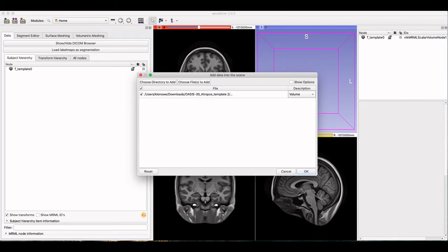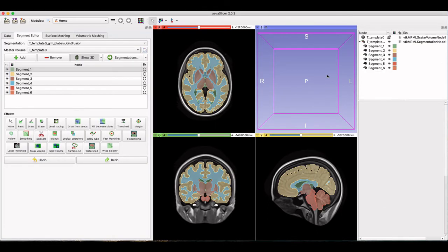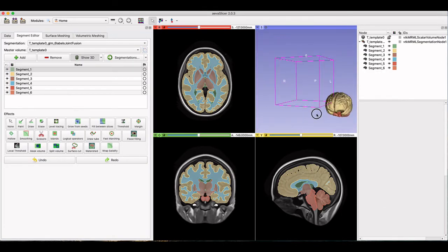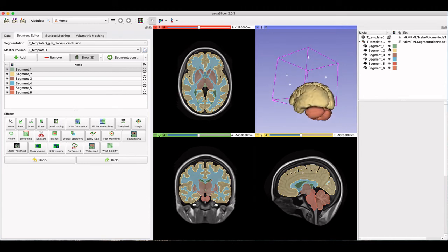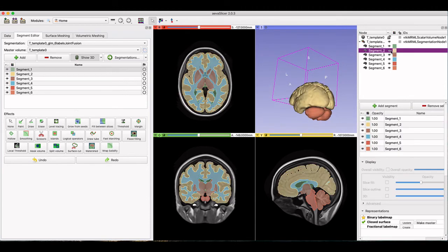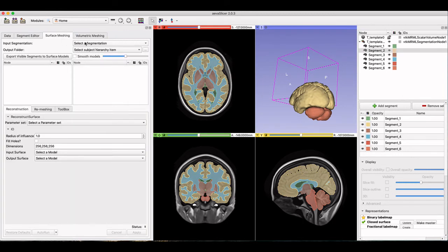In this case, I chose to load the labels as segmentations. Label maps can also be converted from existing STL files by right-clicking in the data panel on the right side of the screen and selecting Export Visible Segments to Binary Label Map.